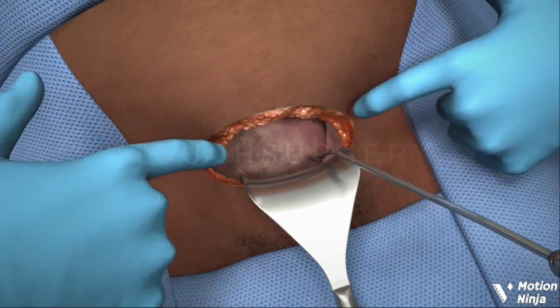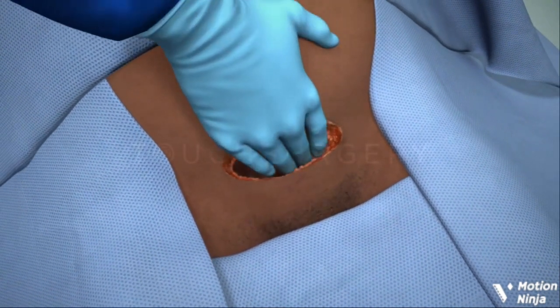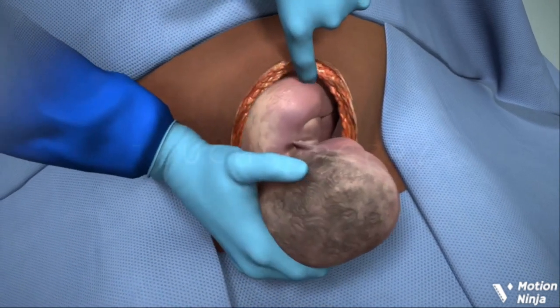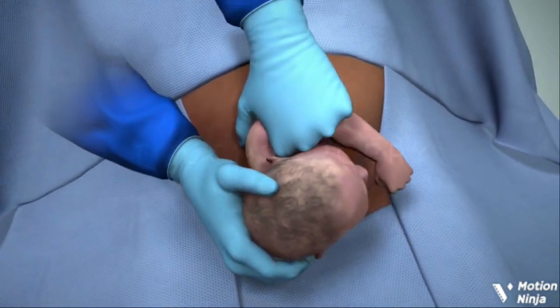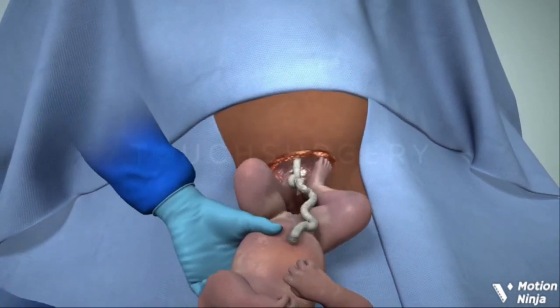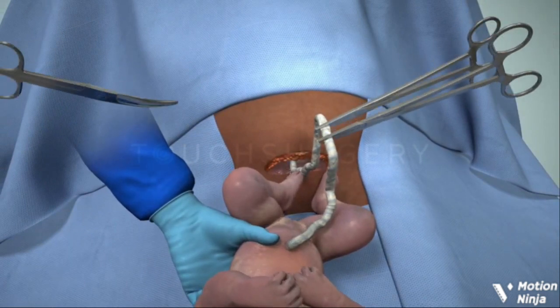The amniotic sac is then opened and the surgeon will now be able to deliver the baby. If the baby is born in good condition and the surgical team have no concerns, delayed cord clamping can be implemented to maximize the oxygenated blood that reaches the baby.